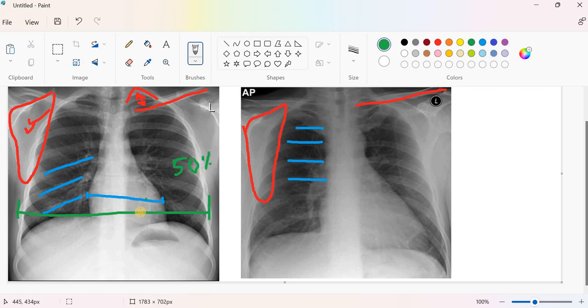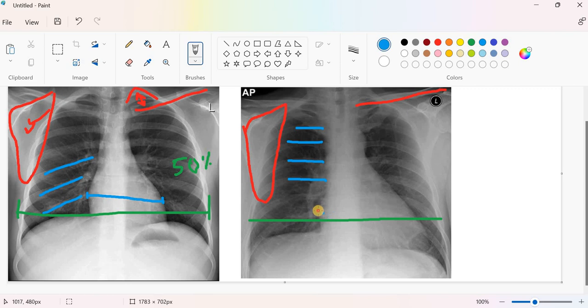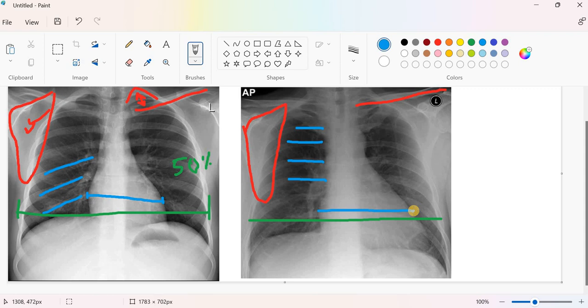If you look to the anteroposterior view and if you compare the farthest point on the thorax, which is called transverse thoracic diameter, if you compare it to the farthest point of the heart, you will find the heart is bigger. It is almost a bit more than 50 percent. It might be appearing to you as 60 percent, 65 percent, whatever is the percent.